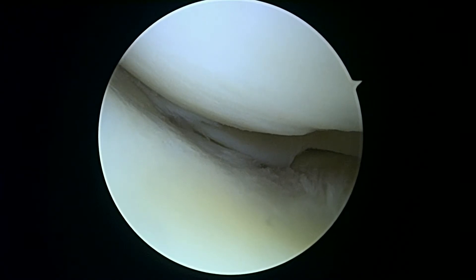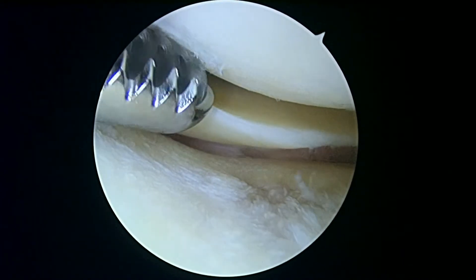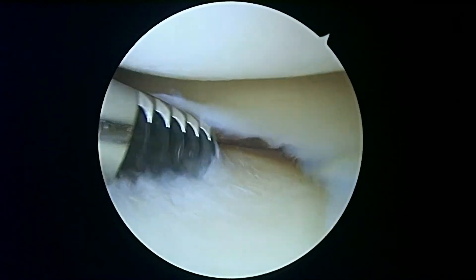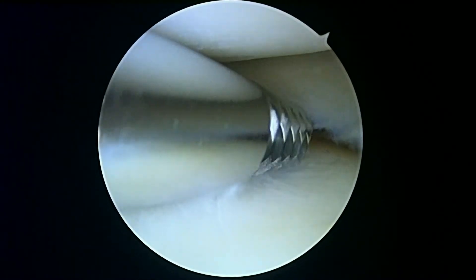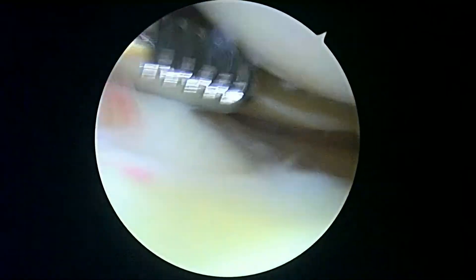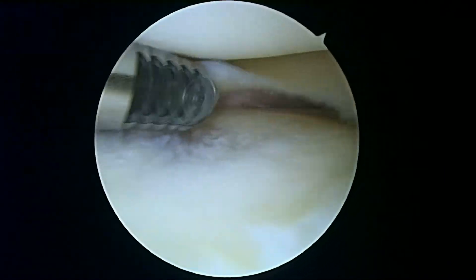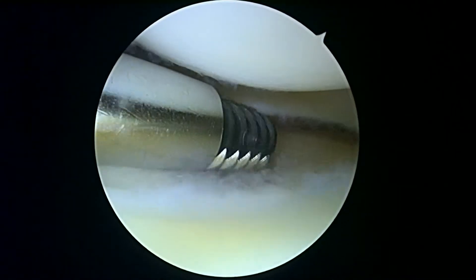This is the lateral compartment. Here's the posterior horn of the meniscus. This is the lateral plateau — again, a little bit soft. But the femoral condyle up above looks like it's in better shape than the one on the medial side. I think we're done on the lateral side. We'll keep looking — if there's anything else we find, we'll show you. But I think that's pretty much it there.